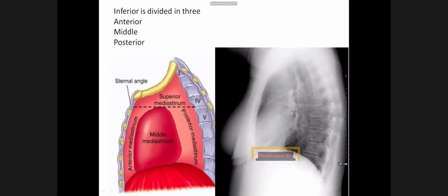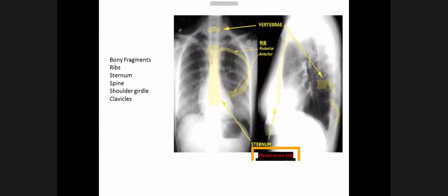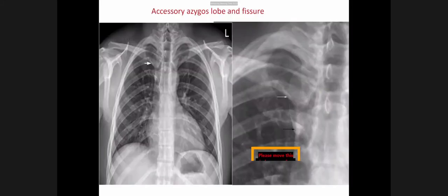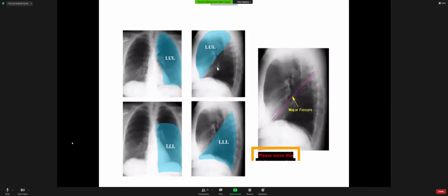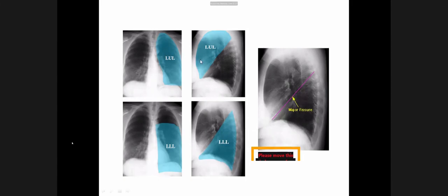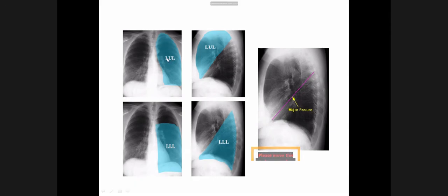Another question, doctor, about the lobes. For the lobes, all the lobes for the right and the left lung, when you give us a picture, you're going to give us both of these pictures together, right? Yes, I will give you, for example, both these views in one slide. You have to look at the frontal.